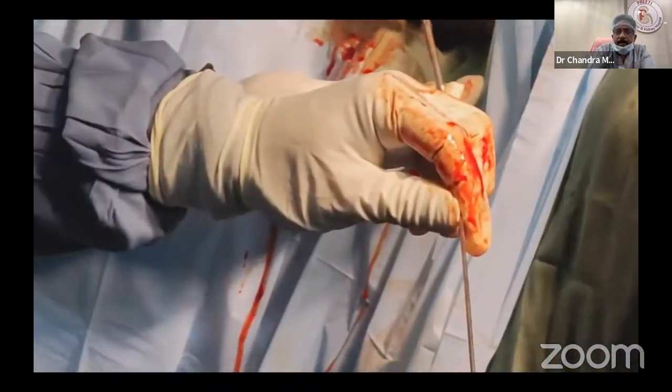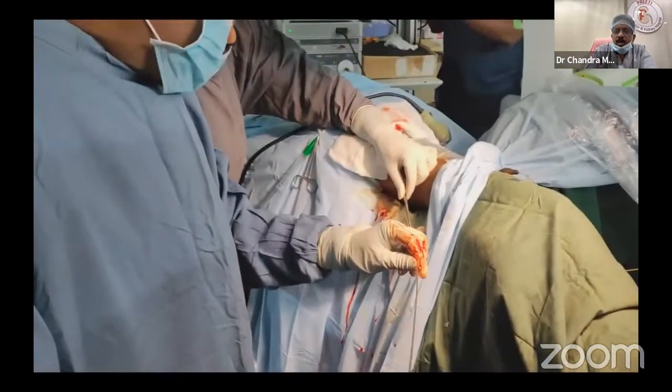Now see, when I am taking out, this is very important. Push the guide wire inside. When you are taking out the Alken rod and dilators, remember two things. One, the guide wire slips so commonly in supine PCNL. Push the guide wire in more and hold with the left hand tip. Second, if torrential bleeding happens now, take out the Amplatz. That's all. No putting in the nephroscope and searching.